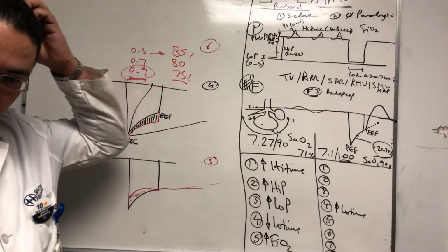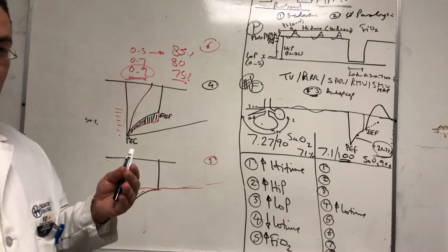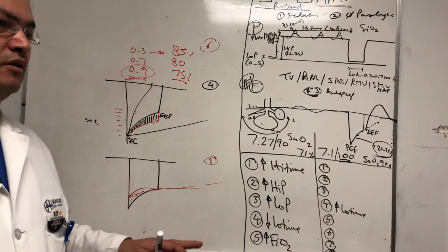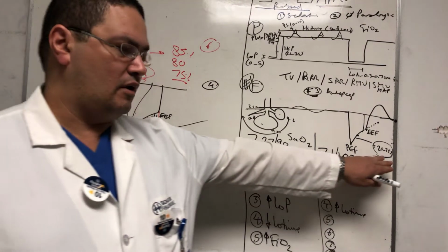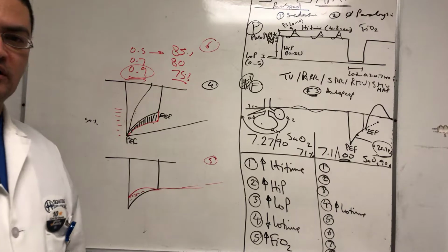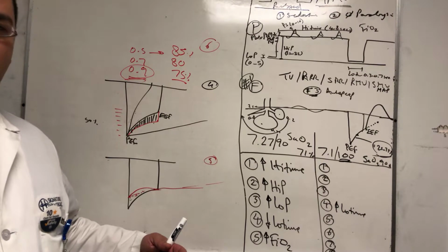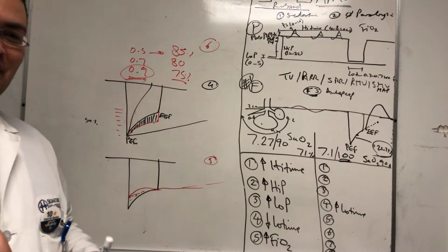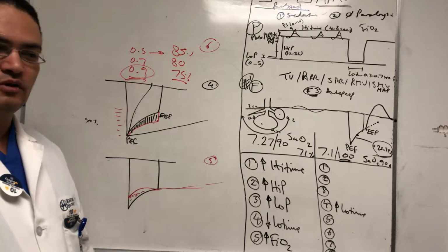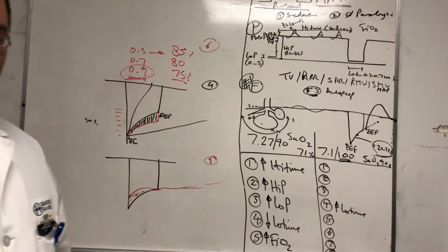This mode of ventilation is a recruitment mode. So having a good low time is part of the mode. If you start saying from the beginning, oh my God, it's so acidotic, let me just prolong the low time, obviously you're never going to go outside this range. But still, if you're going down to make the ratio 30% or 25% or something like that, you're sacrificing the recruitment. You're looking for the early fruit, but down the line you're not going to have the improvement that you would wish for from that mode, right? So it is guaranteed. It's easy. We'll see the effect right away, but don't do it. Just try to do the 3 above first.